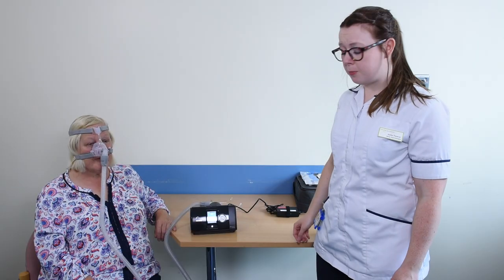When you are first getting used to your machine, you may try various different masks. It's very important to get a mask that fits well so that you can have the best possible treatment. With all masks, we recommend that you try them for at least one week before trying something different.